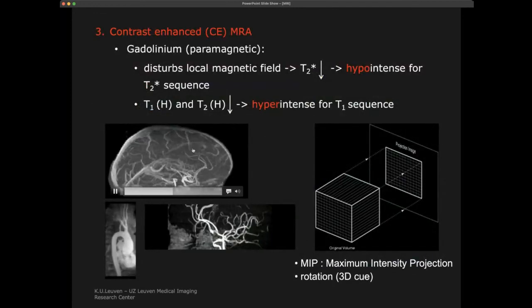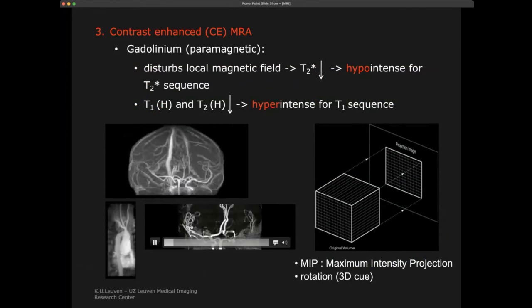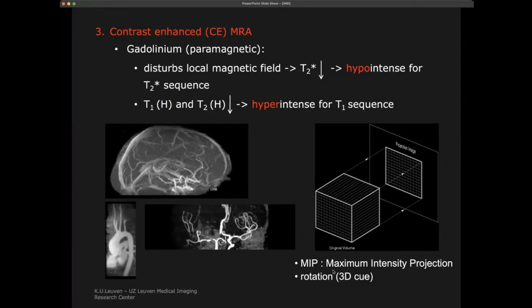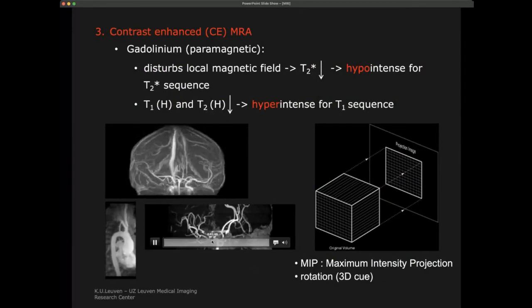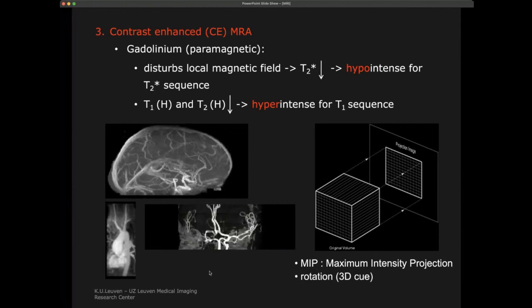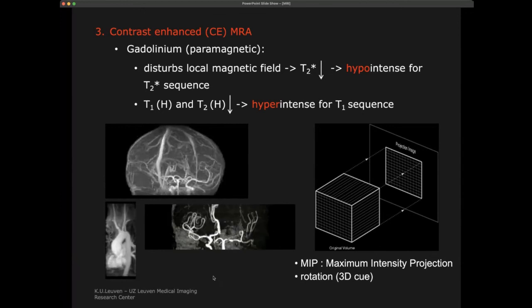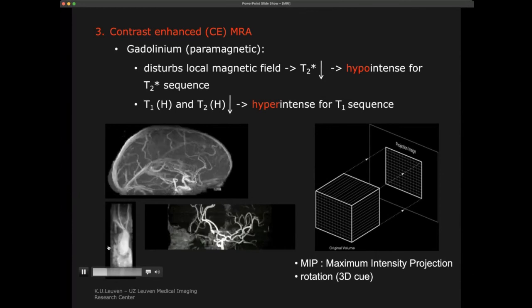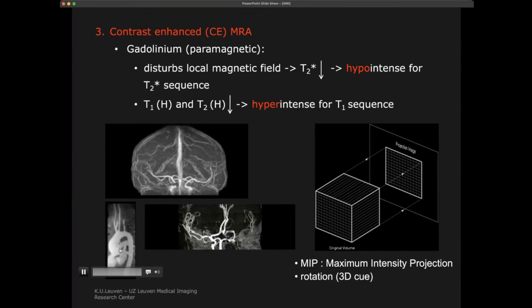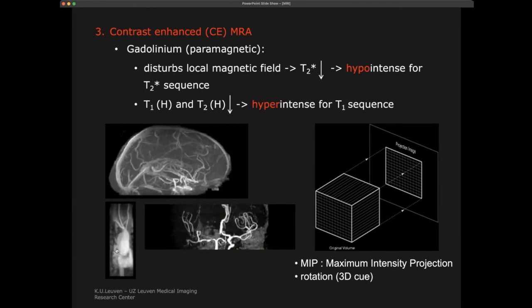And here is an example of an angiography. Well, there's actually two angiographies that are made with contrast agent. And then we can use image analysis, in this case, just maximum intensity projections to show this. But you see that you can actually get quite a nice resolution of these blood vessels. You really get a lot of details of blood vessels when we do this type of angiography. Here's an example of an aorta, and you see this actually is an aorta which is dilated. You see this bulb here at the aorta where it goes up. So that's a patient with a dilated aorta.